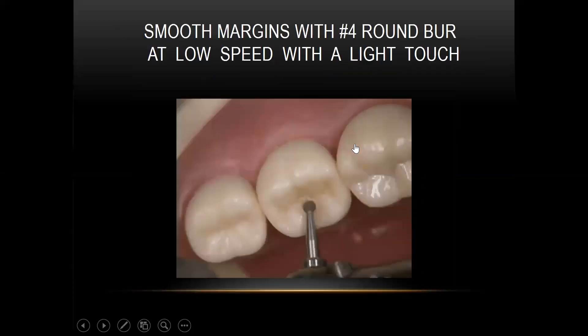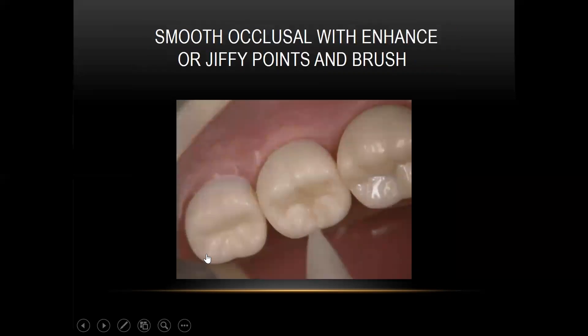We'll get the occlusion adjusted. I like to use a number four round burr for the anatomy and for the margins — it works quite well and is very fast. Then you can go to your Jiffy finishing cups or finishing points through the green, yellow, and white, which will give you a very nice finish.